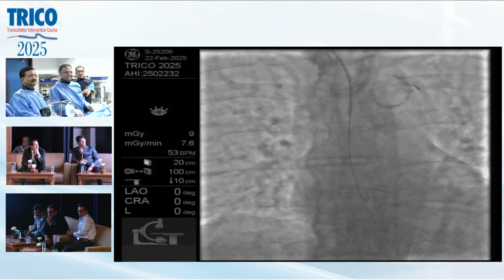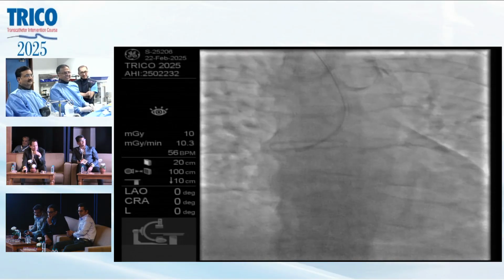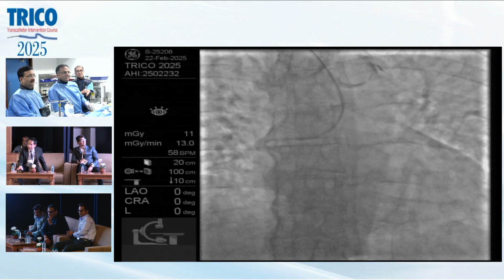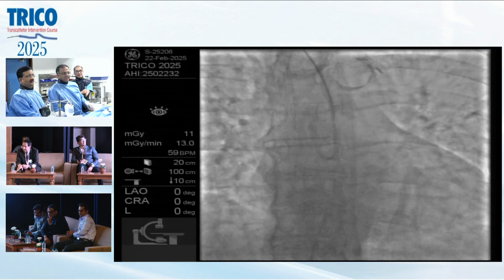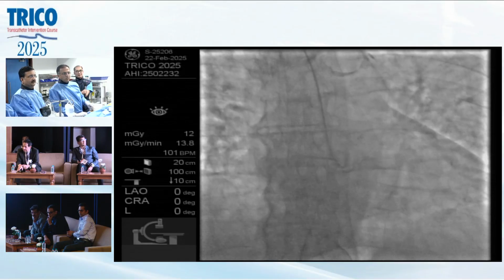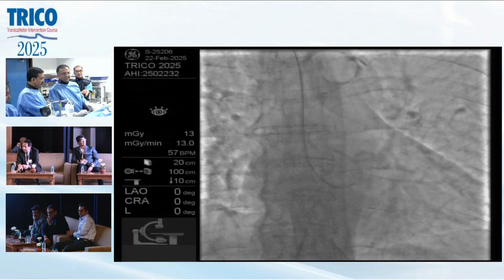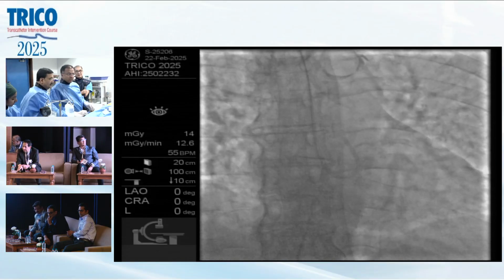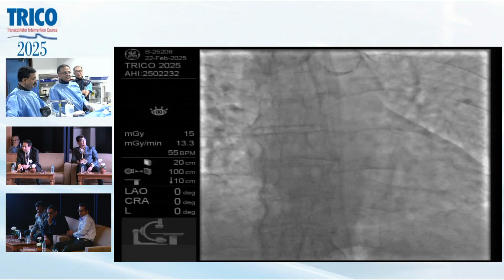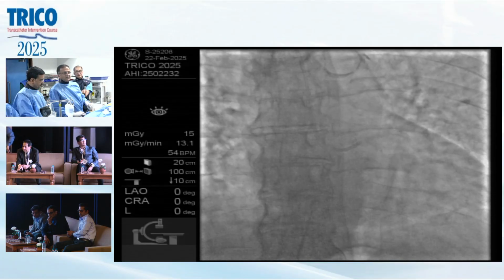I think the picture is just a memory. You just follow the picture, right? Right, exactly. And you have to form the EBU, this window I have in. Form it. Good. And then now let's see if we can sit in. Go to the LV and come back probably. Perfect. That's it. Let's see right there. Okay, good sit.